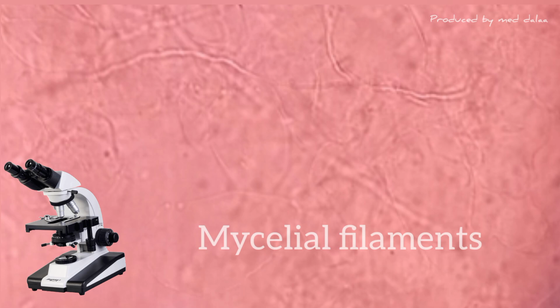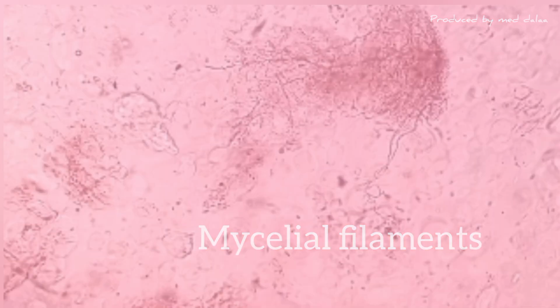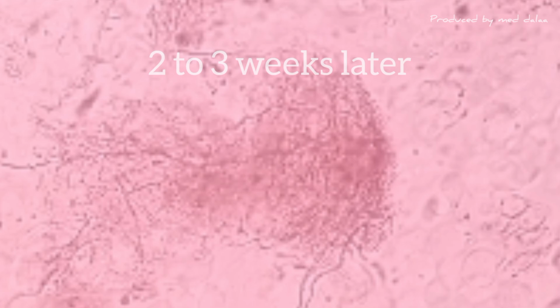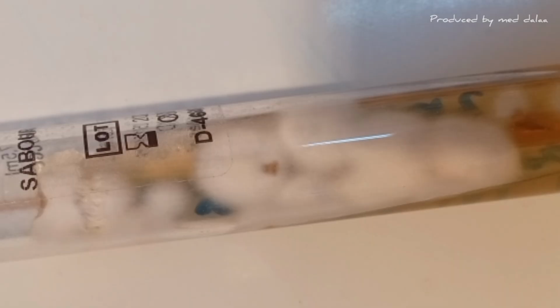3. Culture. In parallel, another portion of the nail clippings is inoculated onto a specific culture medium, Sabouraud Dextrose Agar, which promotes the growth of fungi. 4. Incubation and identification. The culture is then incubated for 2 to 3 weeks. After this period, the fungal colonies that have grown are examined.